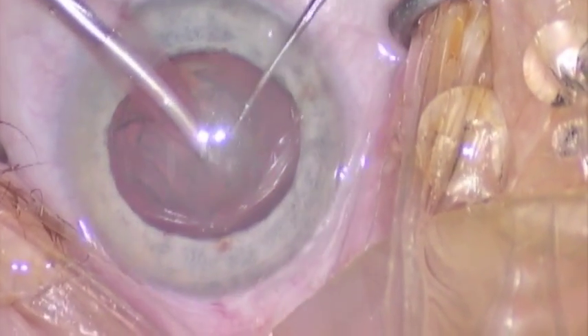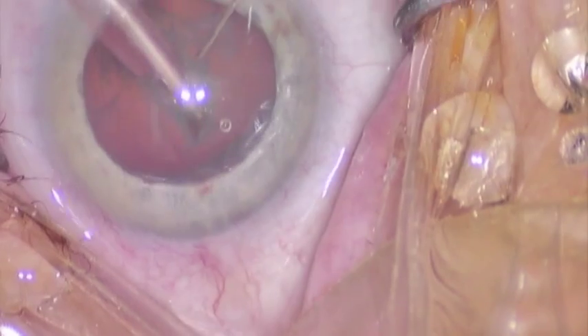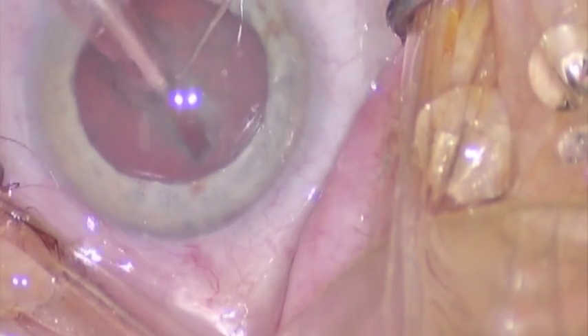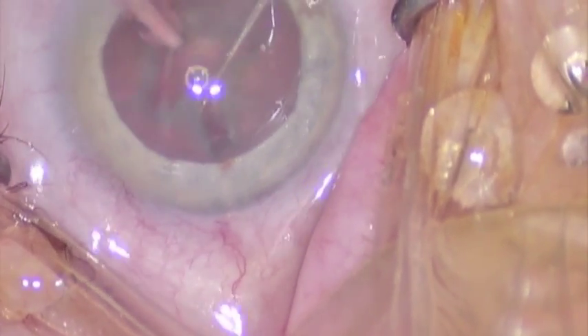We make a first groove, and from that point, rather than rotate the lens, we simply sculpt sideways — using the edge, the sharp edge of the phaco tip — sculpt sideways.